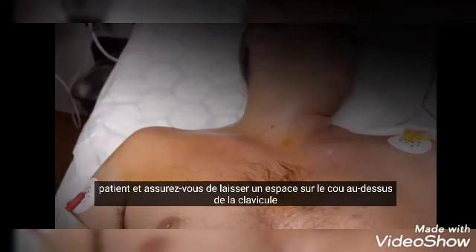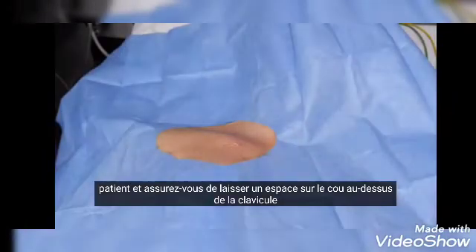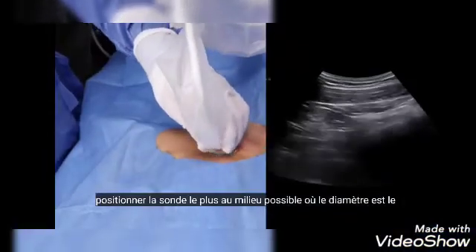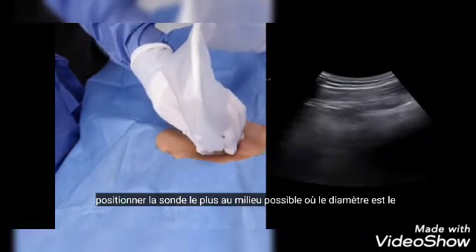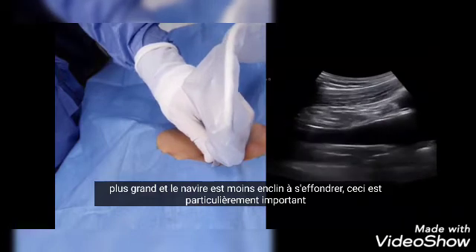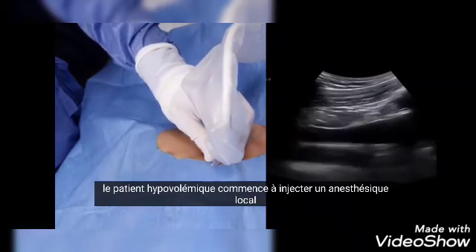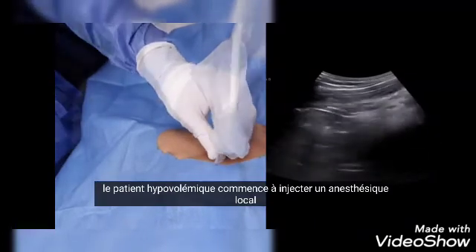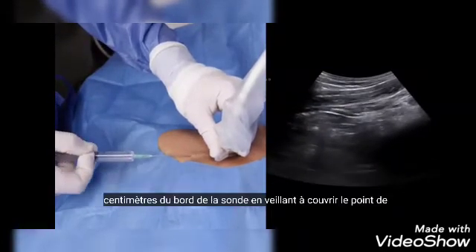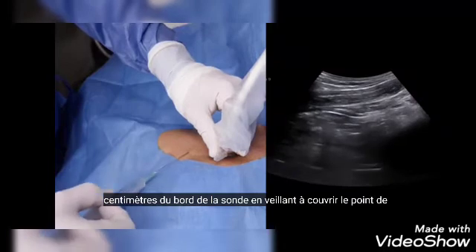Since you do not want to move the probe once you've found the perfect ultrasound view, drape the patient and make sure to leave some space on the neck above the clavicle. Position the probe as far medial as possible, where the diameter is the largest and the vessel is less prone to collapse. This is especially important in the hypovolemic patient.